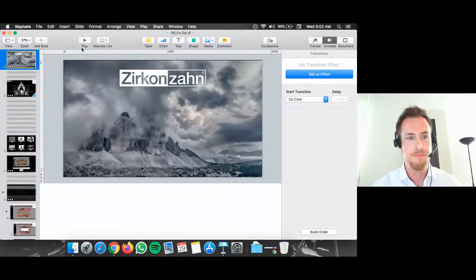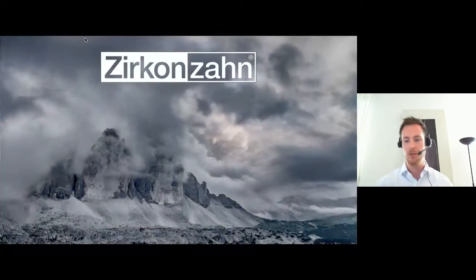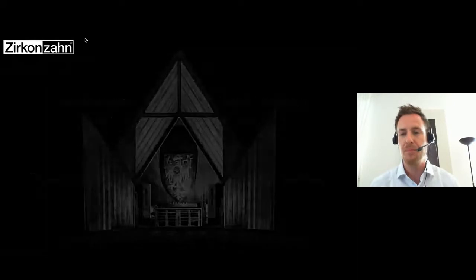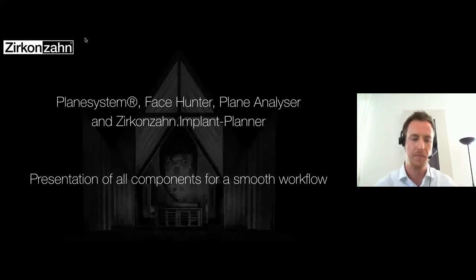As I told you, I want to present to you today the whole digital workflow, and what we can do with it. A lot of people say digital workflow is just intraoral scan or our main CAD software, or CAD software from other companies. But it's more than this.